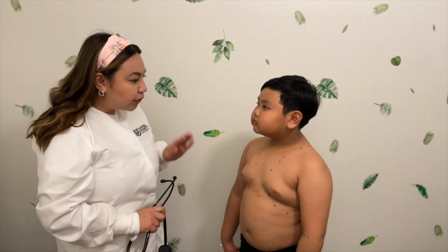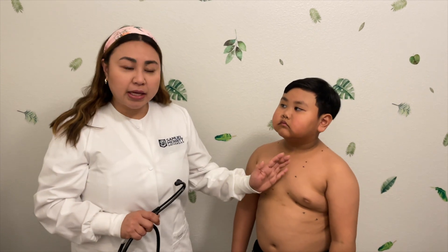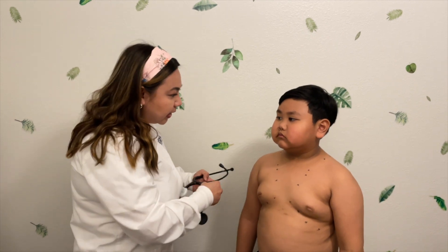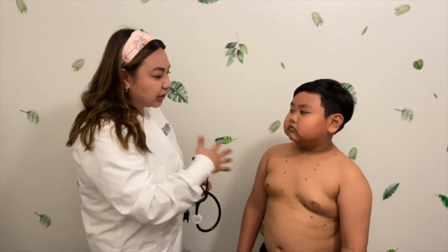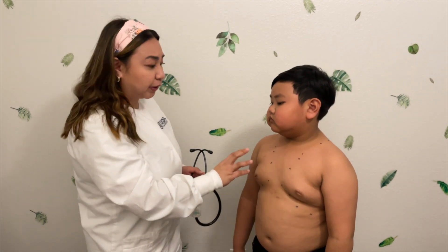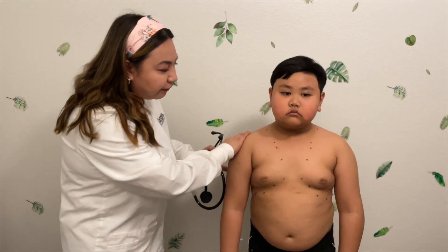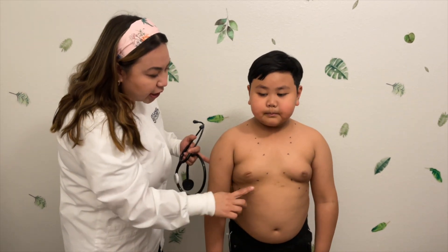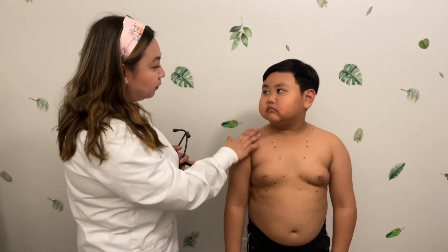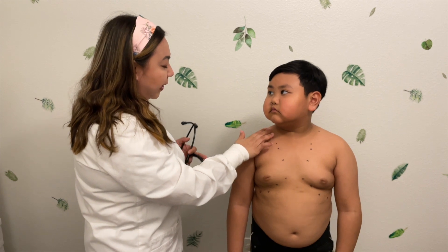The most important part of this assessment is auscultation, or listening for those lung sounds. We want to distinguish whether there are variations from the left to the right, and we're looking for those adventitious types of sounds. As a new student, it is important that I place my stethoscope correctly on the important points of the lungs. I have used these markers so that I can be more familiar as to where I would be listening.